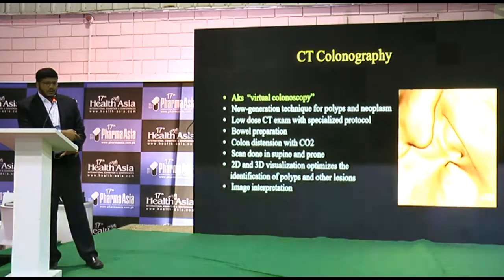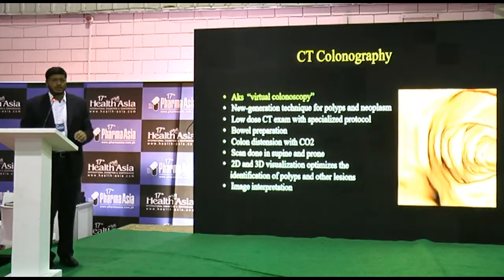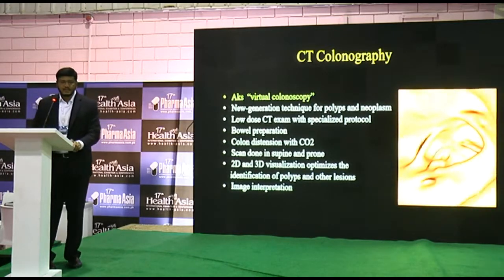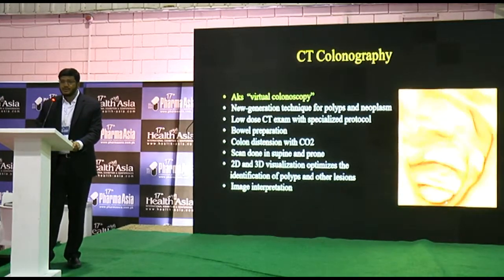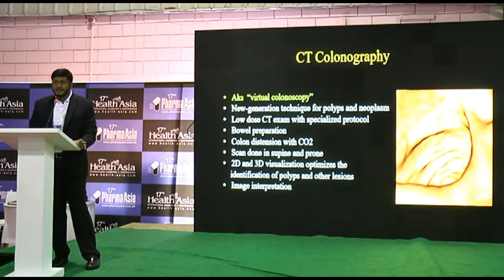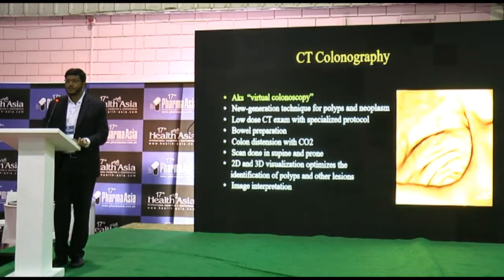Now, regarding colorectal cancer, CT colonography, also known as virtual colonoscopy, is a new generation technique for detection of precancerous polyps or neoplasms. As I said, it is a low-dose, non-contrast CT exam that has a specialized protocol.